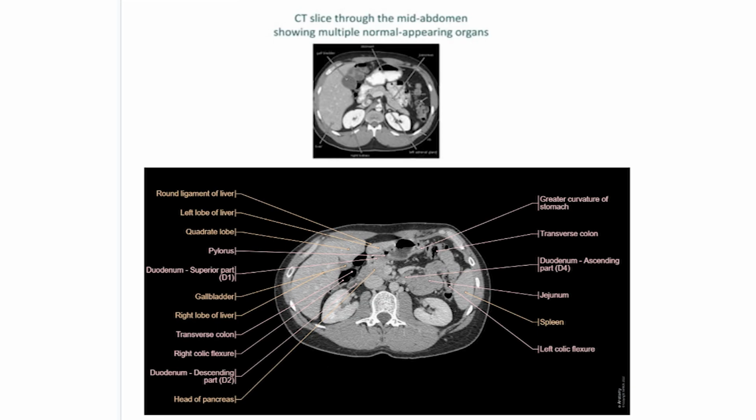Now, with a brief revision, I would like to complete my today's lecture on computed tomography. I have covered drawbacks of conventional X-ray imaging. I have also compared the CT with MRI and ultrasound imaging. I have covered the basis of image reconstruction in CT. I have also covered the CT scan machine, its block diagram, by explaining the function of each block. I have also covered the applications of CT.